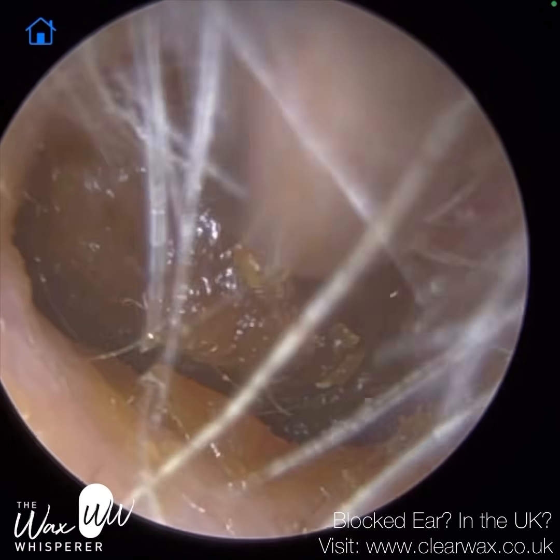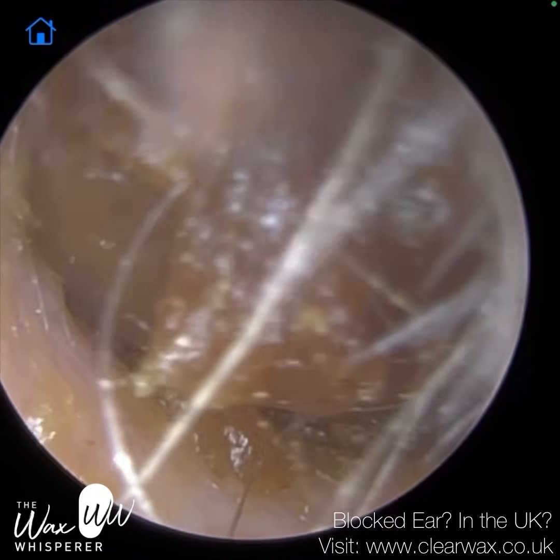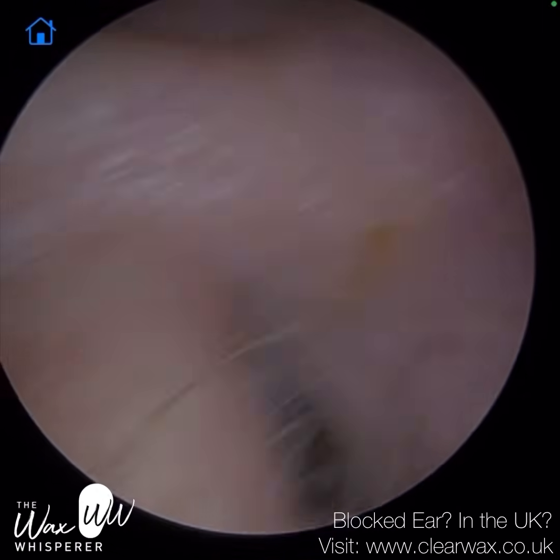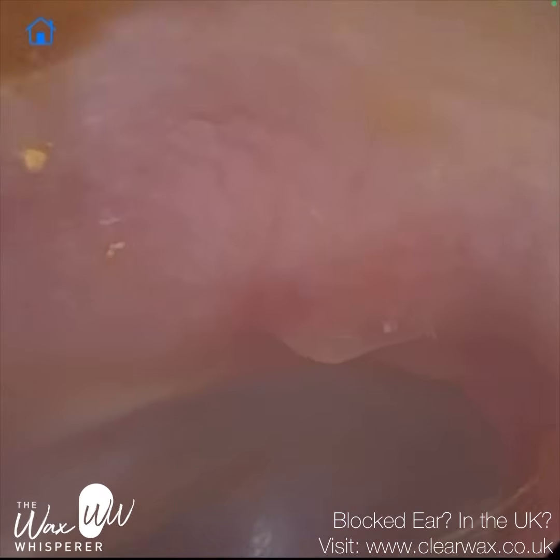So to the right, that's the first bend, and the bend to the left where we are now, that's the second bend. And in between the first and second bend we call that the isthmus, where the ear canal narrows, and quite often that's the root cause of a wax buildup as it's travelling through the isthmus.